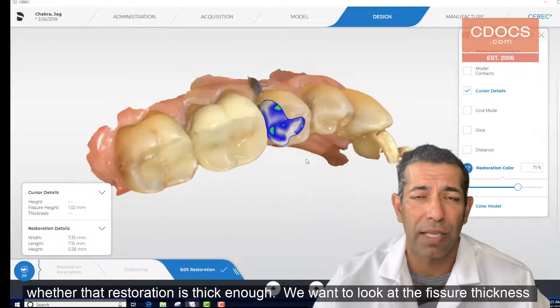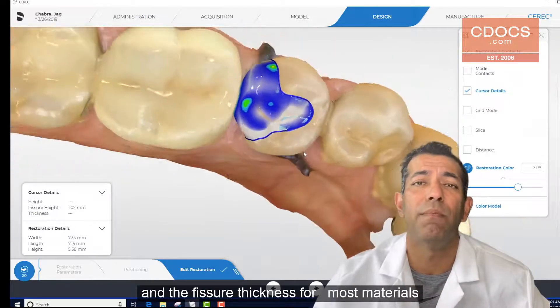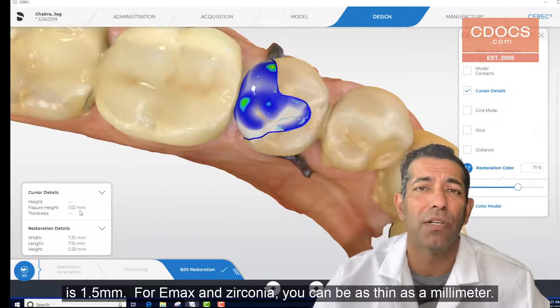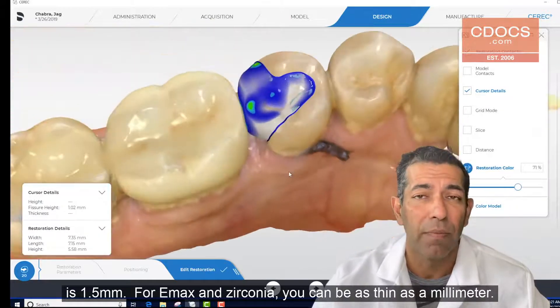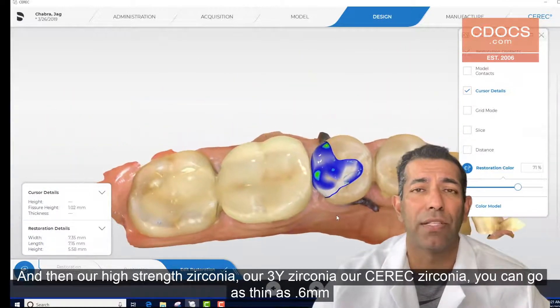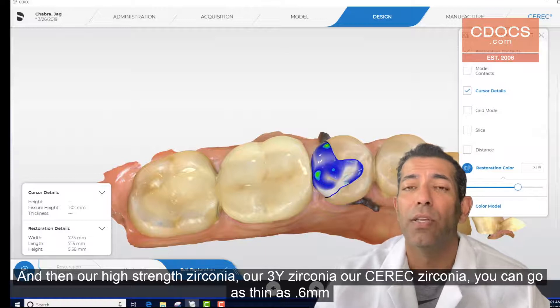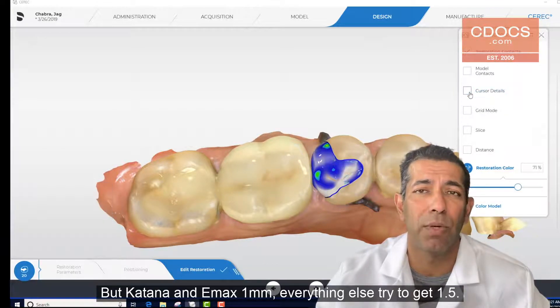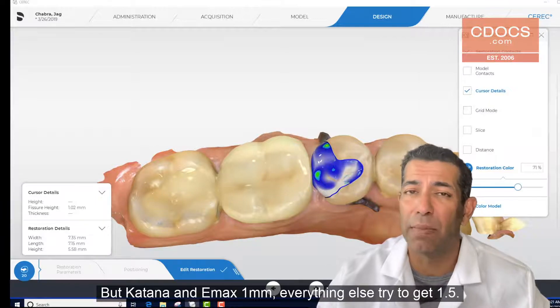We want to look at the fissure thickness, and for most materials it is 1.5 millimeters. For Emax and zirconia, you can be as thin as a millimeter. For our high-strength zirconia — 3Y zirconia, CEREC zirconia — you can go as thin as 0.6 millimeters. But Katana and Emax: one millimeter; everything else, try to get a millimeter and a half.